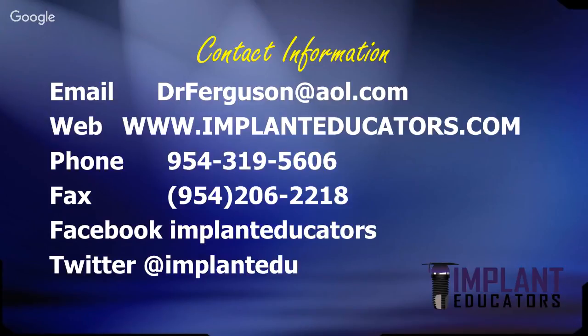So as far as costs, when you factor in your time and such, I don't really think it's a big issue as far as the cost. With the Formlabs, the Moonray, and the Xiav, they use similar resins. The Xiav uses a Moonray resin. We've worked out the settings for the Moonray surgical guide resin and Moonray model resin. For a surgical guide on that printer, you're probably looking at about $4 or $5 per guide to print, or probably less, depending if you're printing it supportless, like using the technique I just showed, where you don't have the support materials. That's going to save your resin as well.